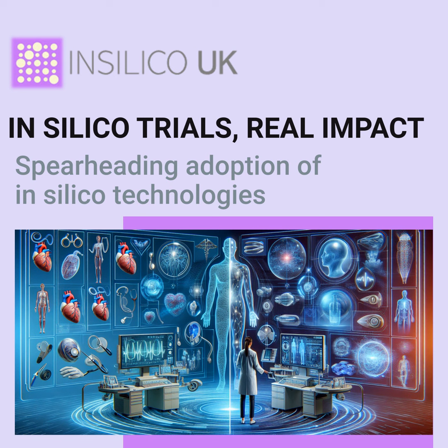Okay, that makes sense. But it's not enough to just create a fancy computer model, right? How do you know that what happens in the virtual world will actually happen in a real patient's spine? Absolutely. That's a crucial question. To make sure they weren't just living in a simulation, they didn't just rely on FEA. They also did real-world testing using a standard method called ASTM F1717. So, a real-world test and a virtual test.